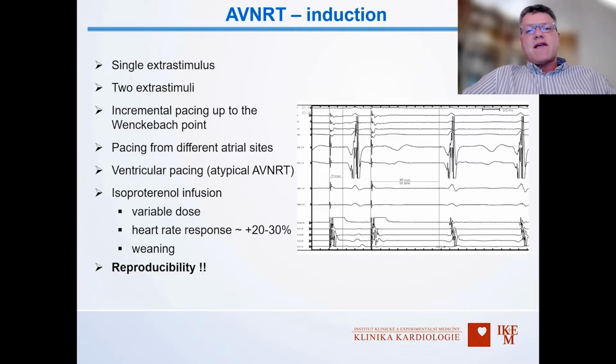Inducibility of AVNRT is not only essential for confirming the clinical diagnosis. Reproducible inducibility also establishes the most important procedural endpoint, i.e. non-inducibility of AVNRT after the ablation. We are not able to induce AVNRT by a single extra stimulus. We use 2 extra stimuli.